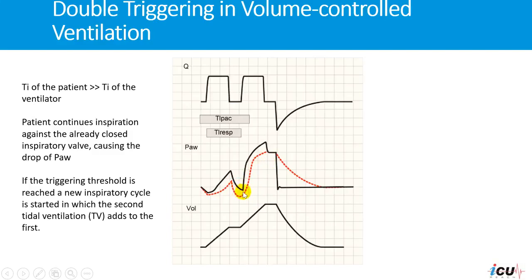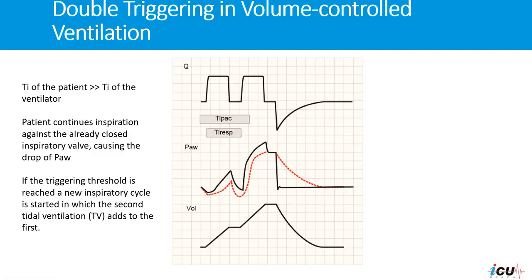Another breath is started and the same tidal volume with the same flow is given to the patient, resulting in two stacked tidal volumes over the first breath and higher pressure as a result of the larger tidal volume in the lung. Notice that there is no expiration between the two breaths.